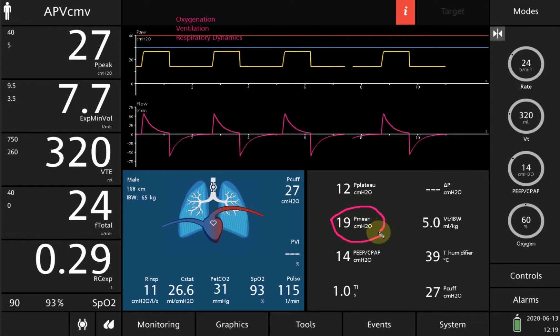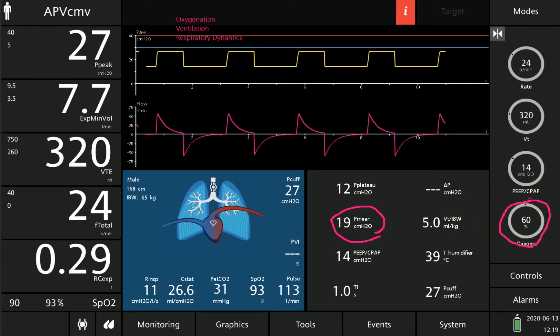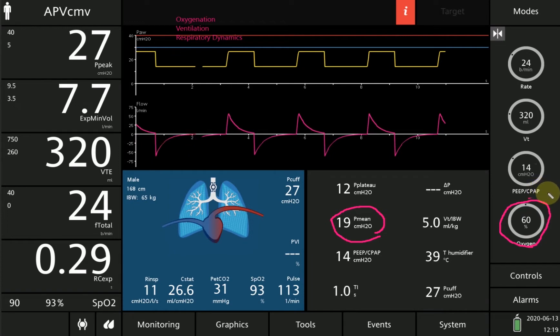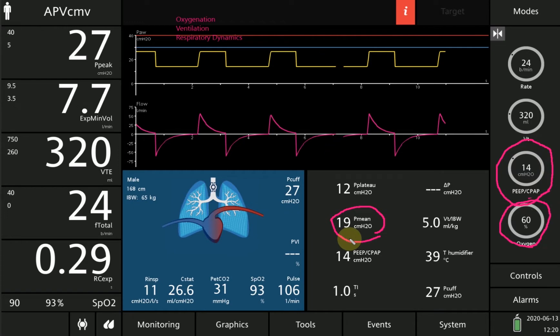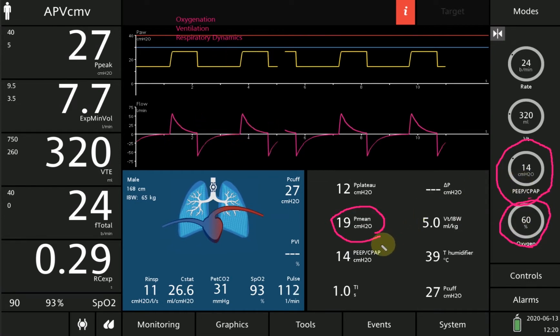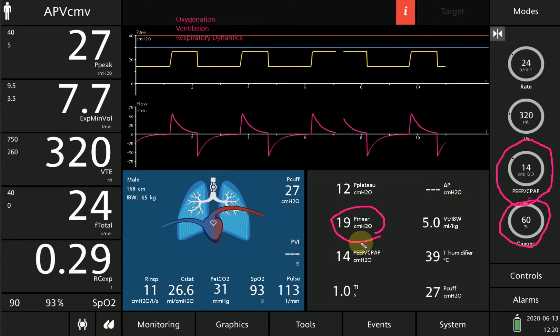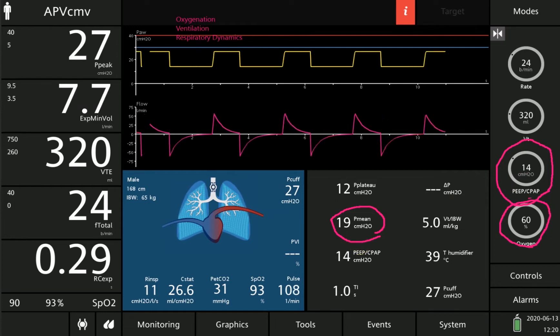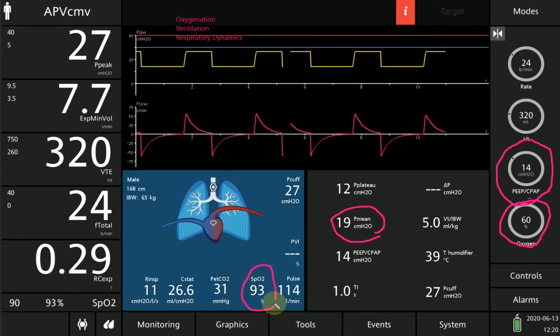The main determinants of oxygenation are the mean airway pressure and the FiO2 level. PEEP is a major component of the mean airway pressure. This patient is on 60% FiO2 with a PEEP level of 14 cm H₂O, a mean airway pressure of 19 cm H₂O, and an SpO2 of 93%.